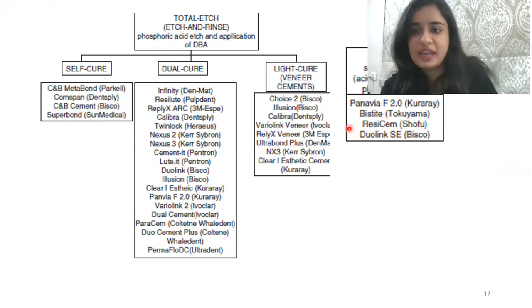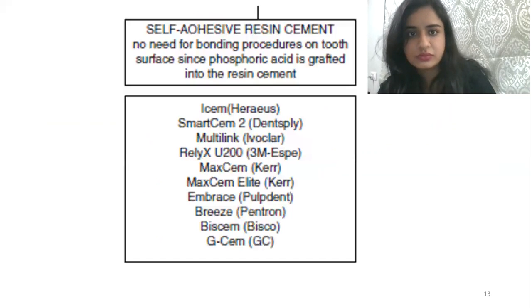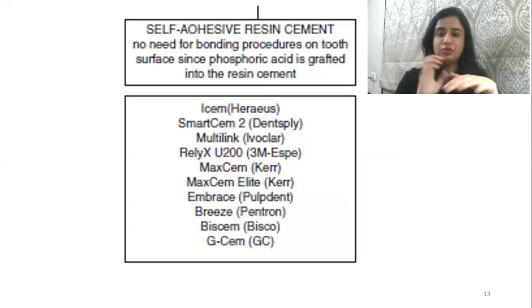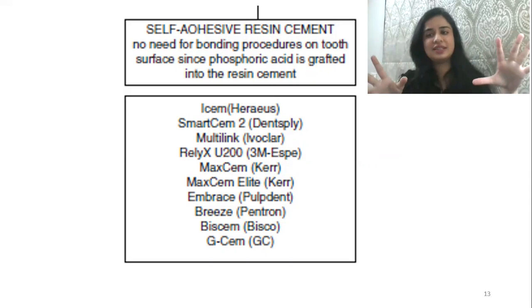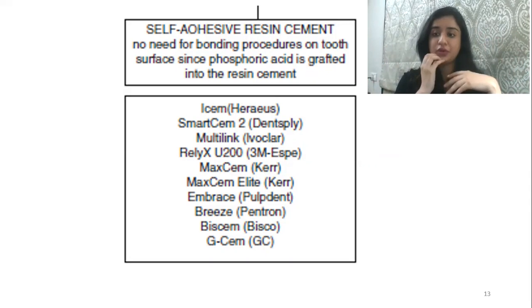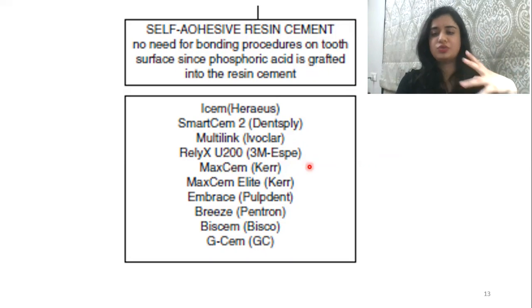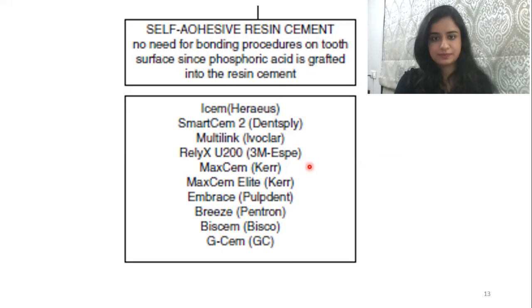And when we go to self-etch, that is going to be self-etch primers, that is Panavia F and again Duolink SE. For self-adhesive resin cement, there is no need for a bonding procedure on the tooth surface since phosphoric acid is grafted into the resin cement. So this is like the easiest cement, but again, you have to know when to use it, as I have already mentioned. In that, we have examples like Multilink and RelyX U200, which are commonly used.